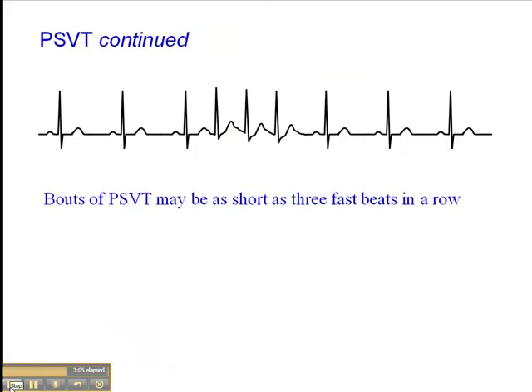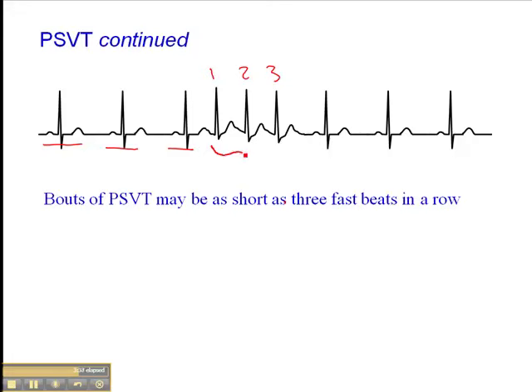The criteria for short bouts of PSVT is that there really only have to be three beats in a row. So we have an underlying sinus rhythm here — sinus beat, sinus beat — and then we have this abrupt onset of tachycardia, which is only three beats in a row. That's really all you need as criteria for PSVT: three or more beats in a row in a tachycardic phase, with abrupt onset and abrupt ending.